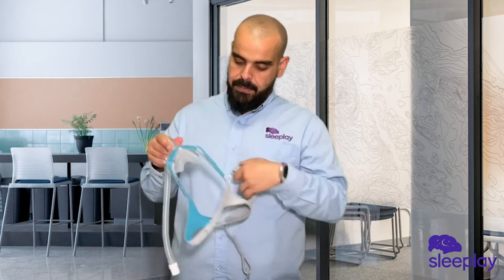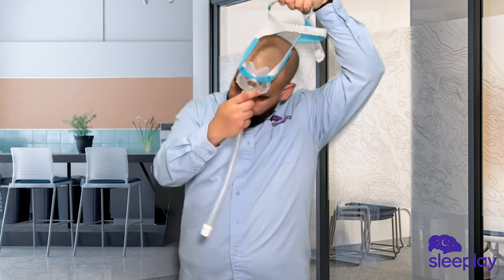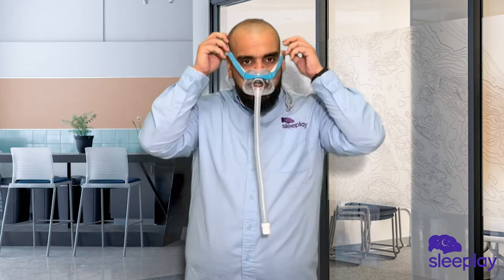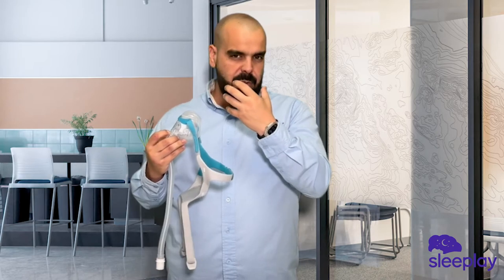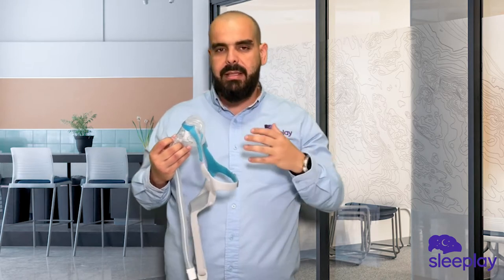Putting the mask on, it's actually very, very comfortable. The breathable part goes to the back of the head, and then you just put it right down and you want your nose to sit right on top of the mask. As you can see, the mask is very small in the front — it's not very cumbersome, it's not blocking your vision at all. I can see perfectly.